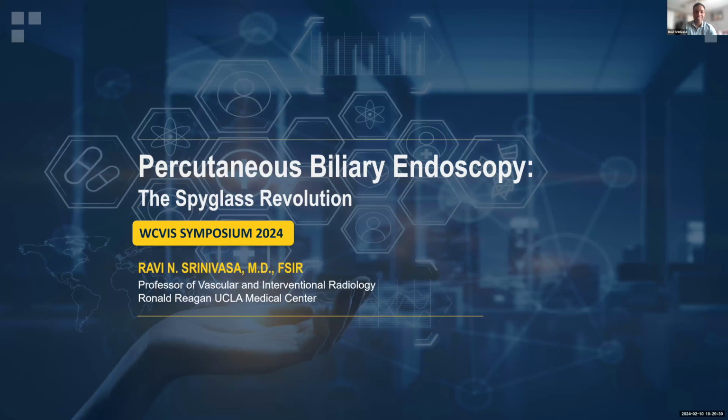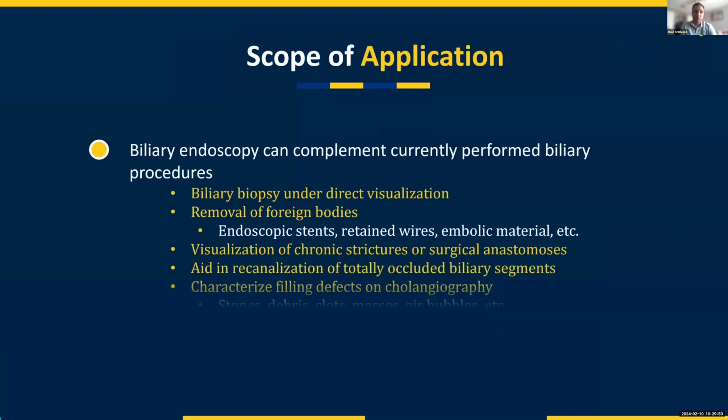So this is about percutaneous biliary endoscopy. This has really had a resurgence over the last few years. It's been around a long time, but I'm glad to see that more and more people are doing it, and hopefully you have been exposed to it in your training already. So we'll just jump right into it.